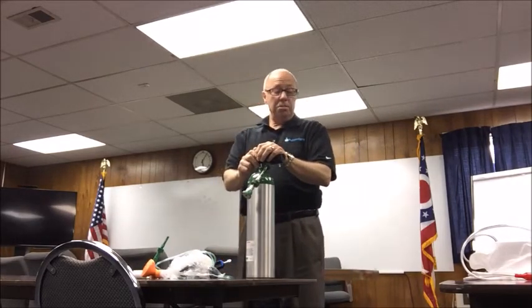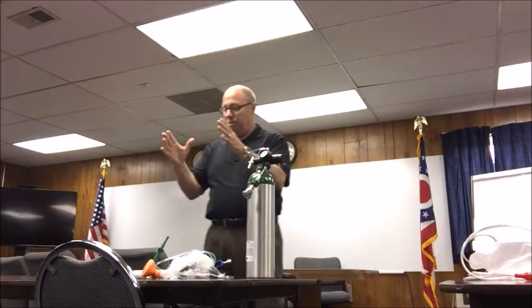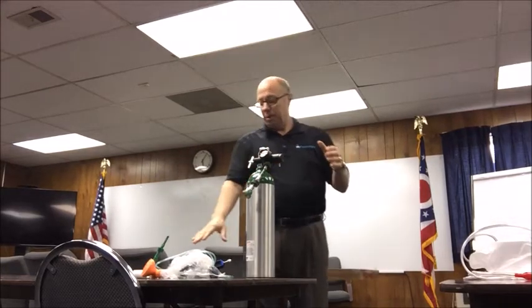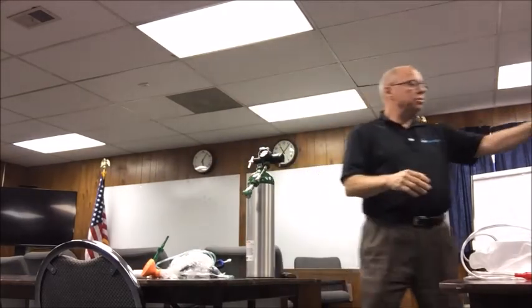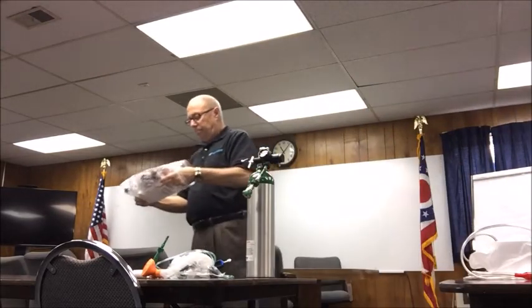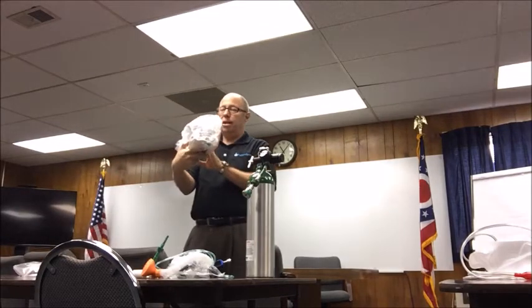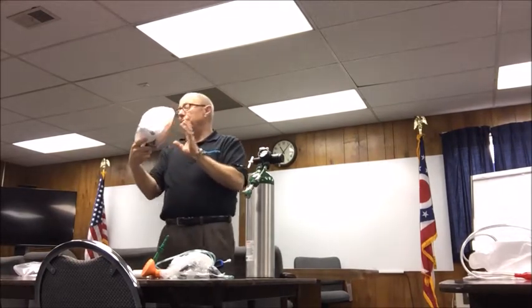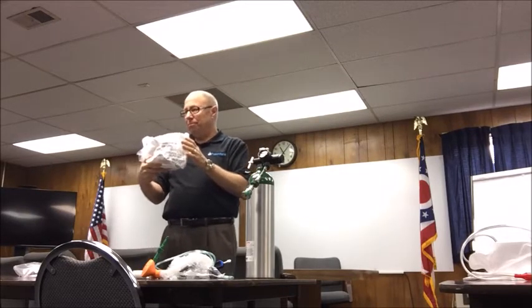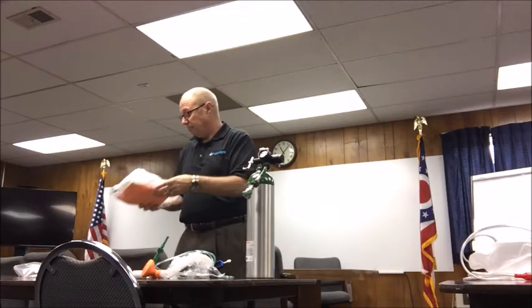So there's 3 things in the bag, and I don't have a circuit with me or encapsulated. Well, yes, I do. I've got a circuit up here. But you can see that it is very compact. Like I said, everything you need to deliver CPAP and nebulize a patient is in this bag. So it's easy to put on supervisors' cars, back of trucks, whatever.